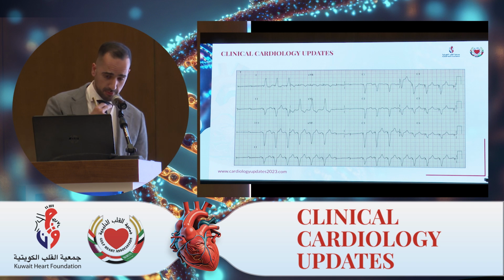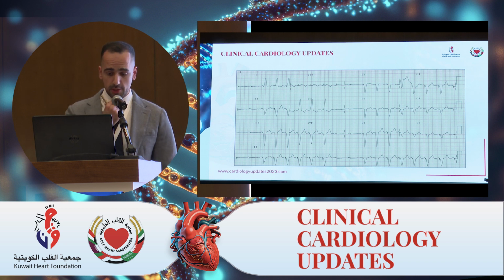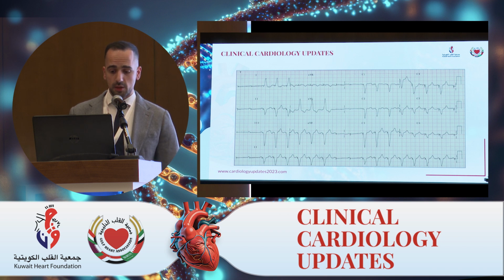Here I have an example of a patient who has a dual chamber pacemaker, and right off the bat, you can see something's off. You can see in the lower rhythm strip periods of no QRS complexes. If you pay closer attention, you'll see this patient is in sinus tachycardia. Each P wave is followed by a pacing spike. However, not all these pacing spikes are followed by a QRS complex. And this is failure to capture.